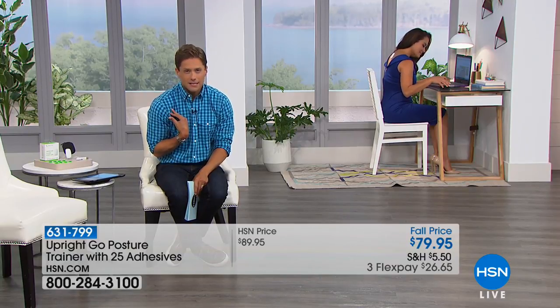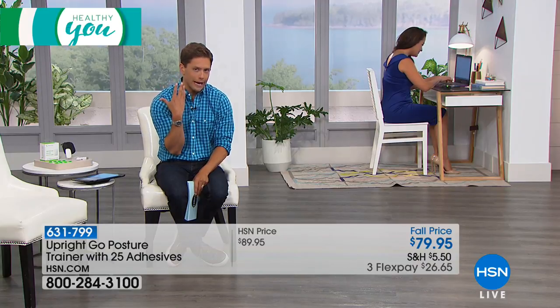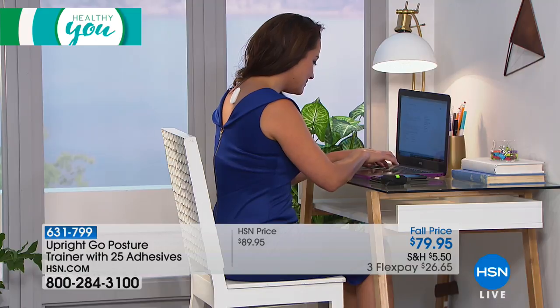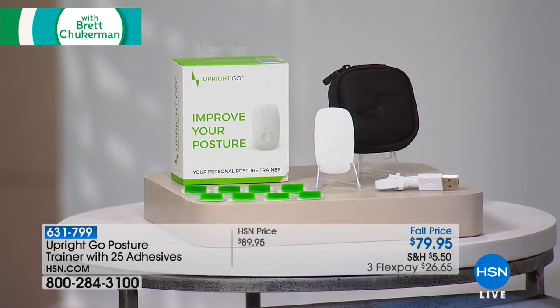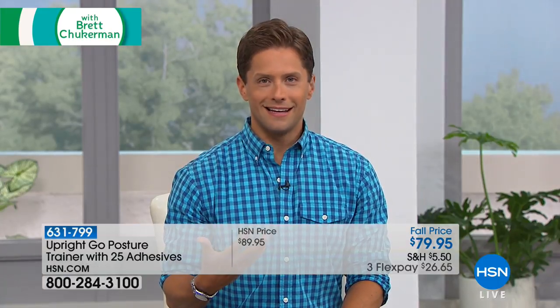So improving your posture is very, very important. To help you improve it and prevent the negative impact on your body, we have a brand new innovative item — it's called the Upright Go, and it's a posture trainer. We all know we're sitting in front of our computers, at our desk, in the car. We know that bad posture ages us. We know we feel that slump all the way up through our neck into the back of our brains. Wouldn't you like a reminder to sit up straight whenever you start to slouch? The Upright Go posture trainer is just that — a little device that you adhere to your back and it vibrates when you slump.